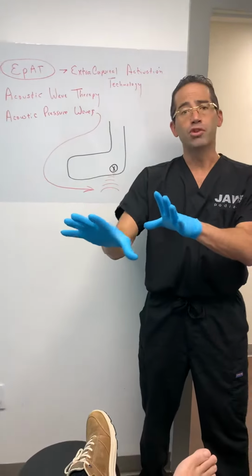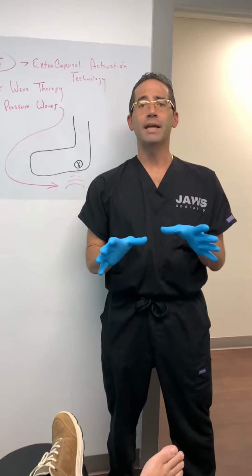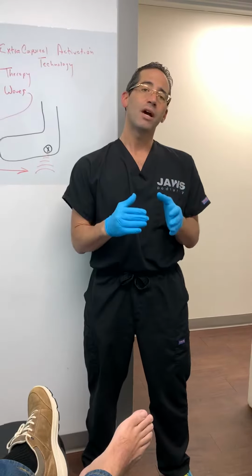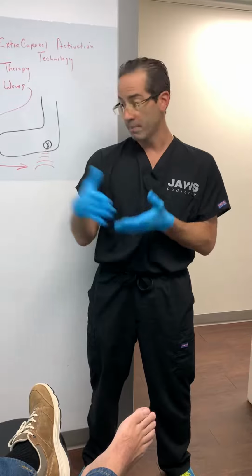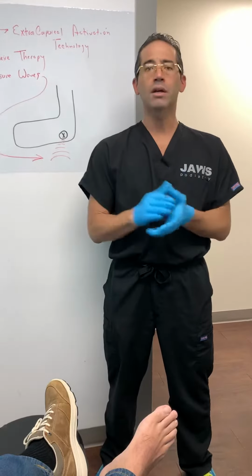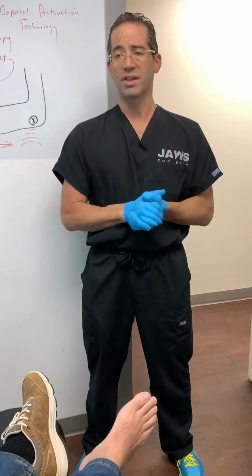This patient was here yesterday. The patient came in with a chief complaint of heel pain, acute heel pain. We went ahead and performed a platelet-rich plasma injection, a PRP injection, and now part two is today, which is basically performing the shockwave therapy. Depending on the clinical presentation, it can be anywhere between 3 to 4 sessions.